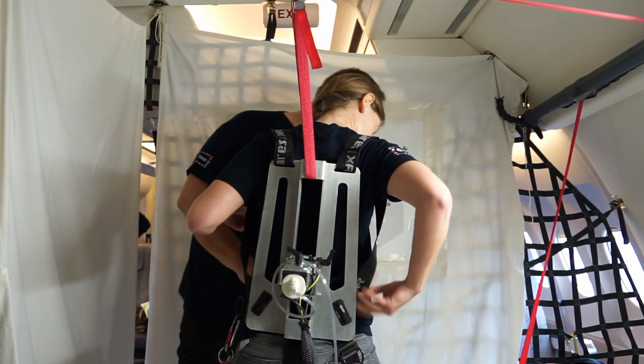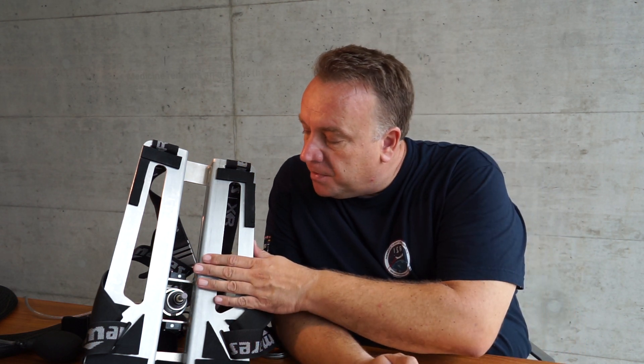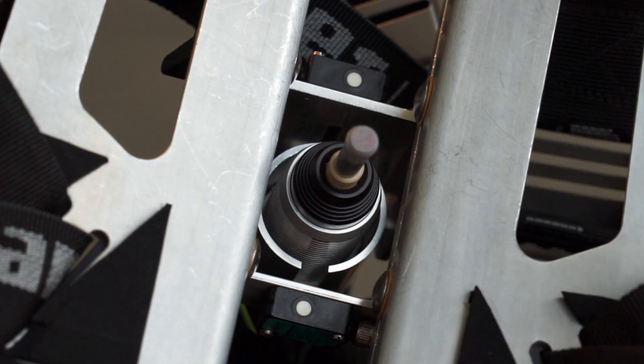This will be carried like a backpack during the parabolic flight campaign by the participants. Additionally, we will measure the distance from this apparatus — here you see them here and here — to the lower back of the participants to anticipate the spinal curvature. So if it changes, for example in hypergravity, the curvature will, we expect, increase. We can see it on these numbers.